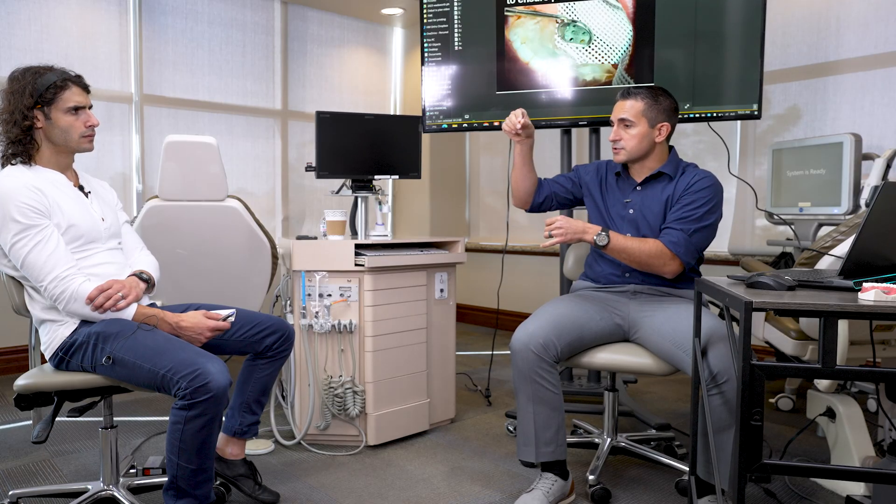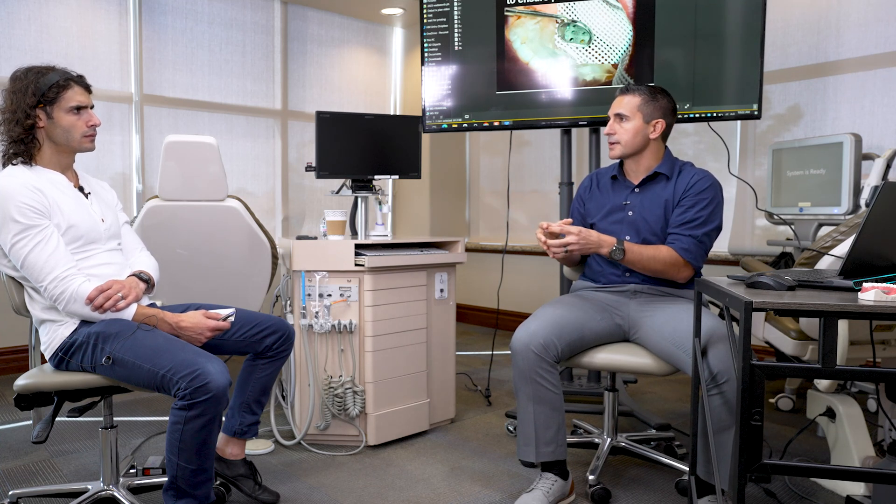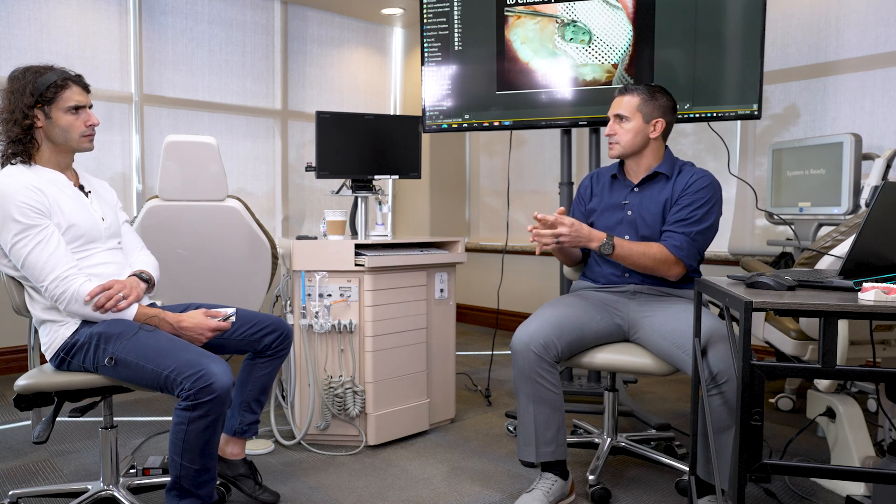From my standpoint, it's a lot easier and more predictable to pilot first. You take a small drill — there are different piloting drills — and you puncture that area. With FME specifically, the guide is designed to fit as ideally as possible. It's a 3D-printed plastic guide, so that piloting drill can only go straight up and down in one specific area. You pilot, puncture the hole, then a second drill takes that hole a little further into the spongy bone, so when the TAD goes in it has a site ready to receive it at the exact planned angulation.